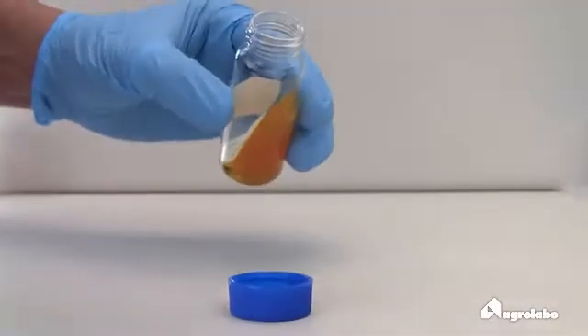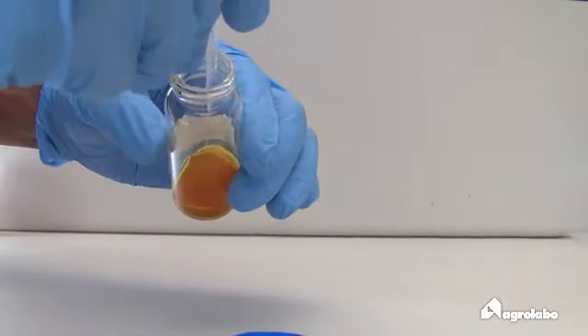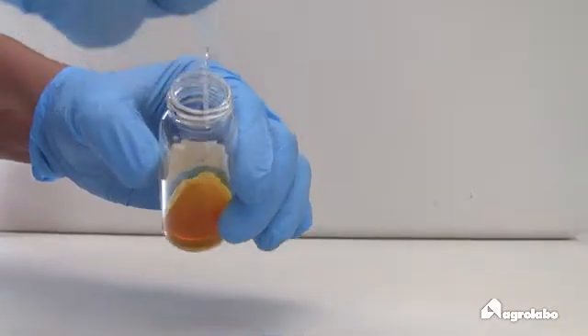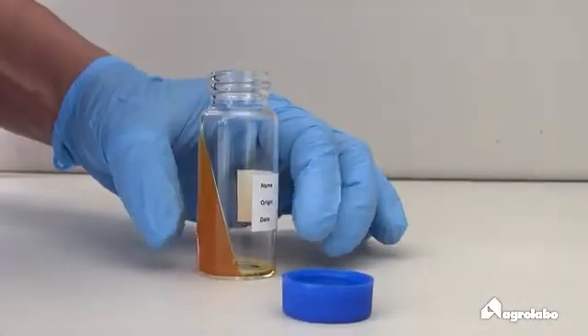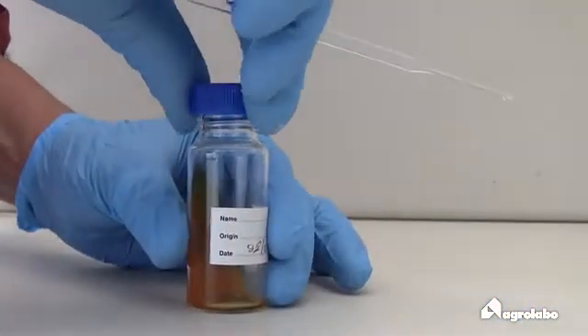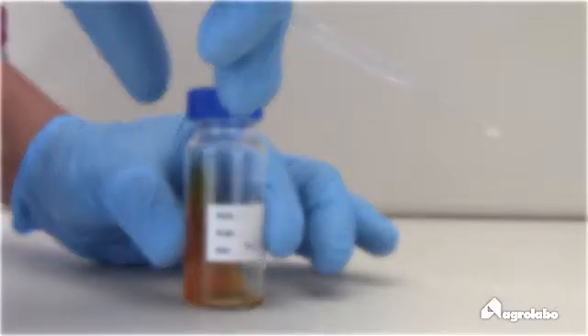Add the sample placing it on the surface of the culture medium without cutting into it. Close the tube without completely tightening the lid to avoid the formation of moisture that could alter the result.